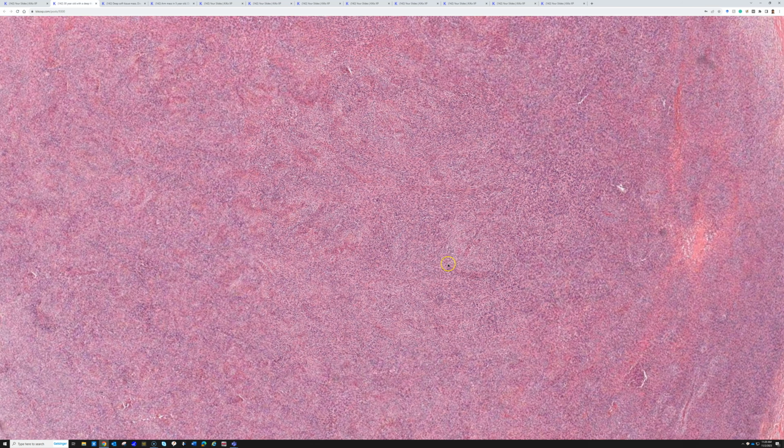A subset of these sclerosing epithelioid fibrosarcomas can have that same FUS-CREB3L2 fusion that you see in low-grade fibromyxoid sarcoma, but most of them actually have EWSR1 rearrangements with CREB3L1. You can do some more reading about that, but I just want you to recognize this pattern because it's kind of unique and could be confusing if you had never seen it before.